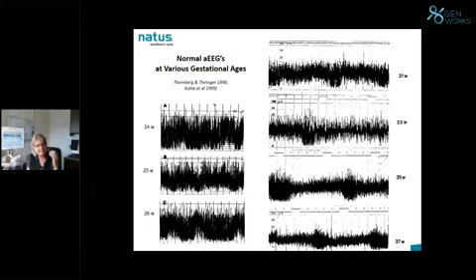And that's actually best seen in the lower border of the trace, which gradually starts to increase in its amplitude from the kind of 2 to 3 microvolts you see in the extremely preterm to over 5 microvolts, 5 to 7 microvolts, probably in that sort of 33-weeker there.